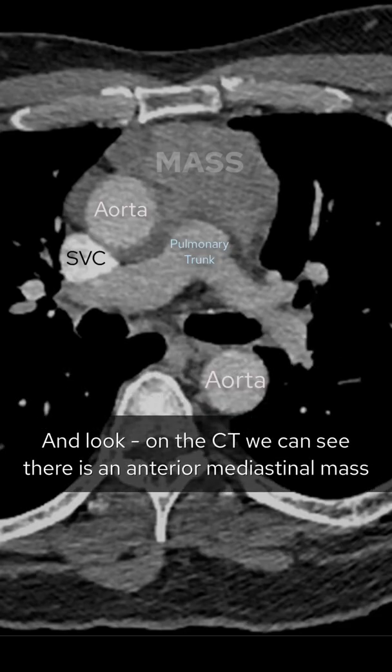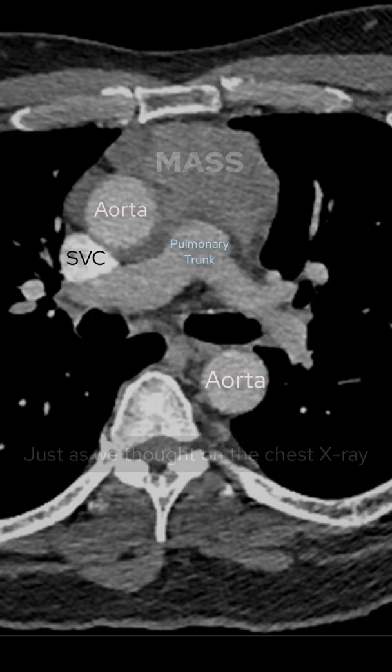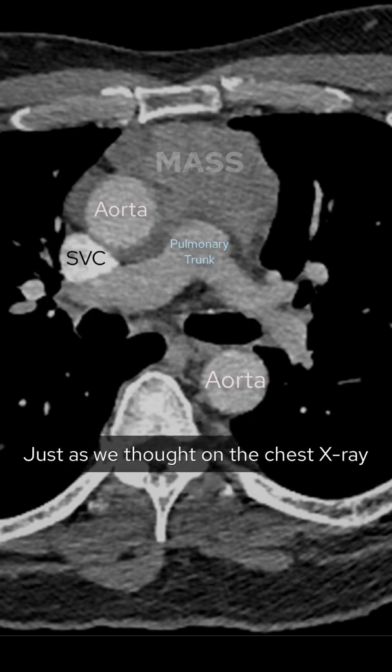And look — on the CT we can see there is an anterior mediastinal mass, just as we thought on the chest x-ray.